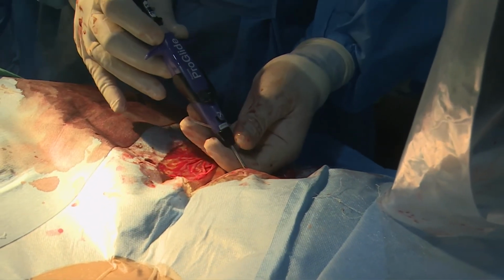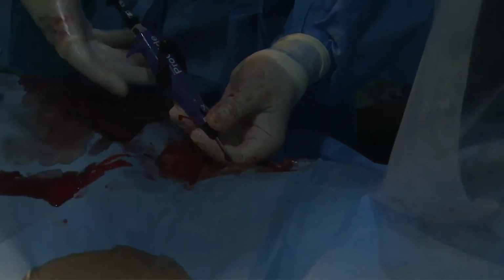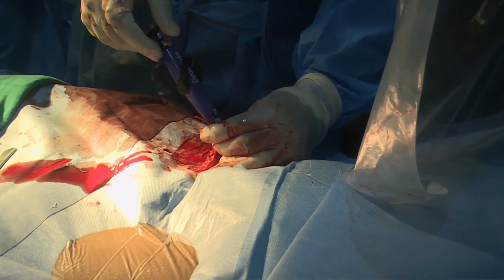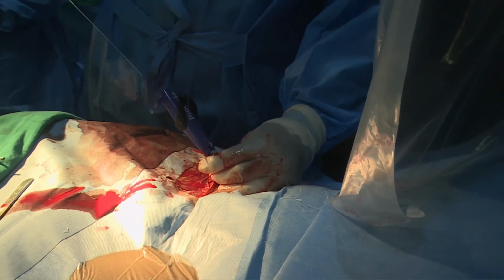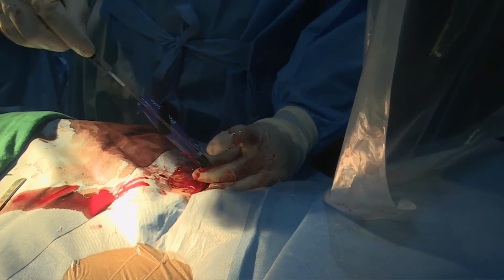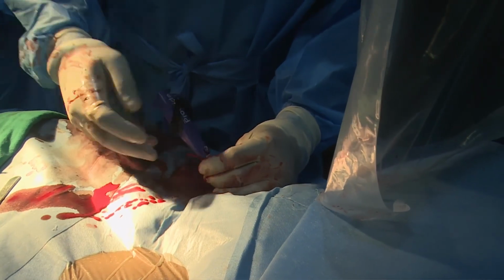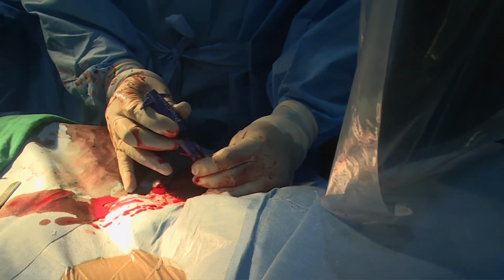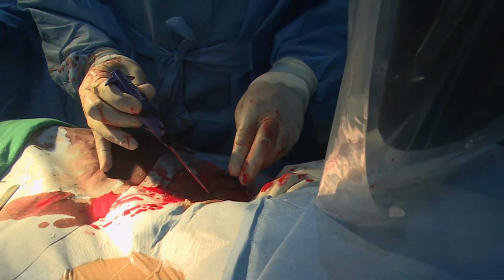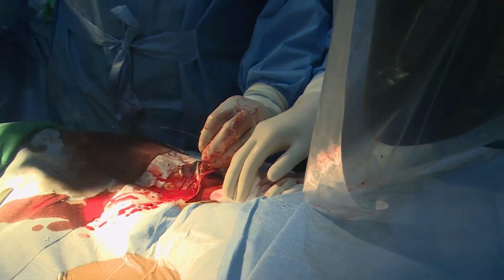Now you see the blood will come. You see the blood is coming. Now you make this up, withdraw, and you have to stabilize this, and then step 2 and 3. Now you remove this and make it tight, okay. Now you cut it, and once you cut it, go little down, again close it, and then come up. And once you are coming up, just hold, you remove the sutures. There will be 2 sutures, okay. So just press it little harder.